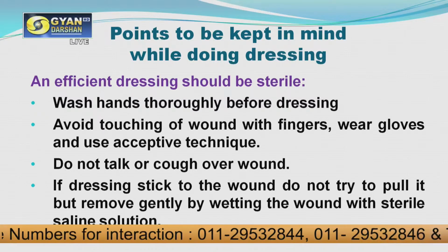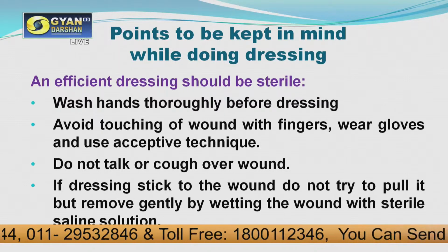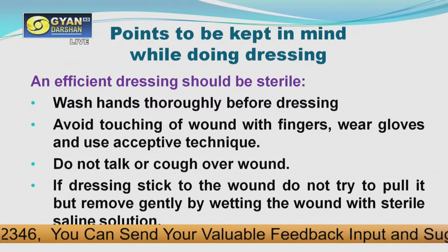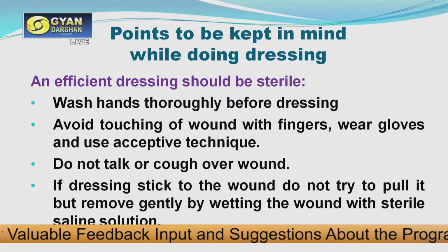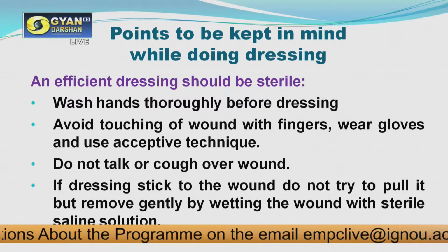And if the dressing sticks to the wound, do not try to pull it, but remove it gently by wetting the wound with sterile normal saline solution. Once you have wet the wound with sterile normal saline solution, it will get soft and then it can be removed easily.